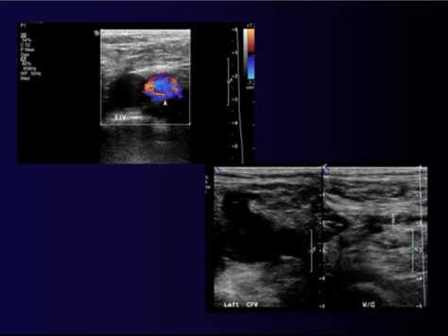Okay, so this can be tricky in examination. We can see here on a color Doppler view of the external iliac vein, there is flow in the artery, but no flow in the vein. So as I mentioned earlier, compression is actually the most important part of the study. And you can see here, during compression, the vein completely collapsed. So this is one of the pitfalls when evaluating for thrombosis. Color can sometimes simulate the absence of flow, but really what is happening is there's very slow flow.